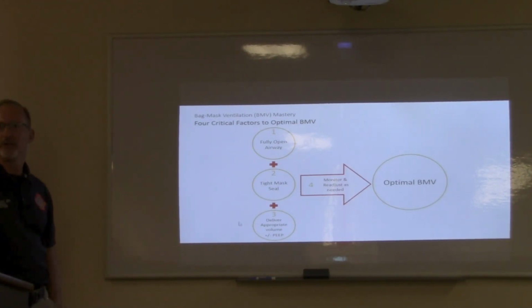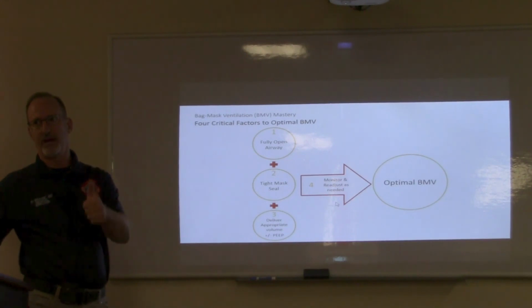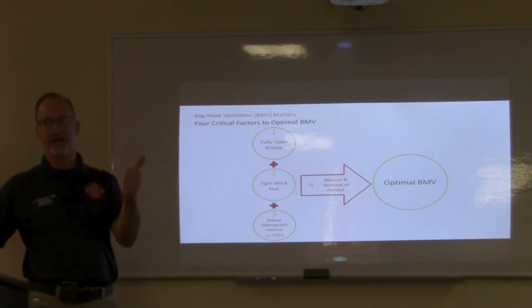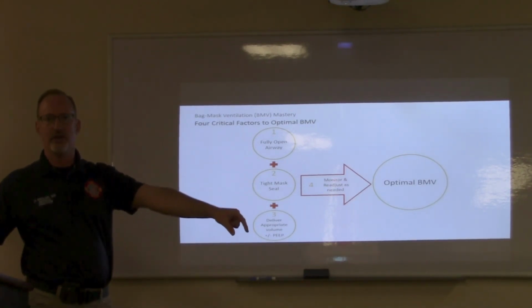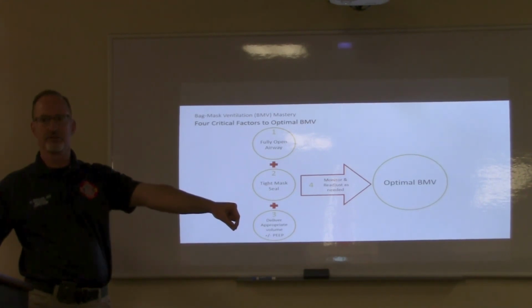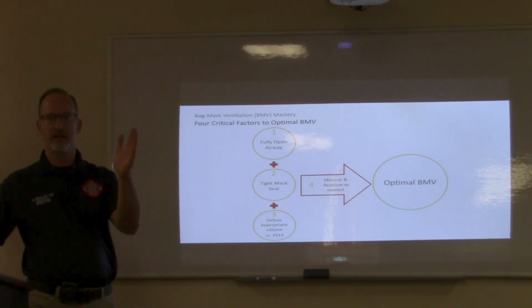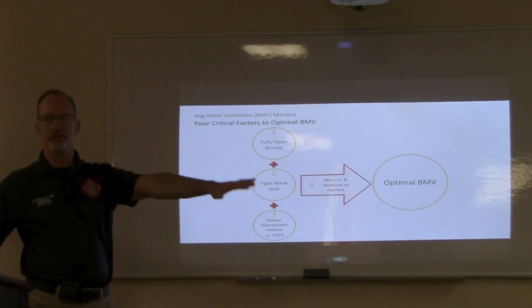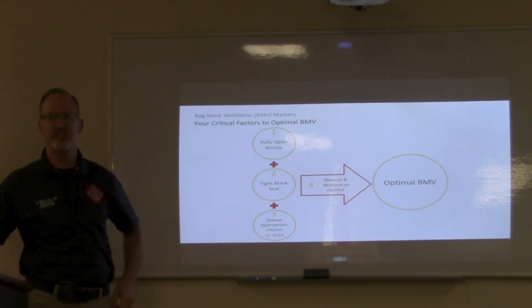All right, we covered a lot of ground. It sounds like the thing that probably needs some continued review, so go back and go over this with your crews: capnography and all the things we can do with capnography in particular, and mask ventilation versus non-rebreather for cardiac arrests. And then get out a mannequin and just talk about how you're going to make sure you can do all these things not to overventilate patients. That's the homework assignment. Any questions, comments, teaching pearls?